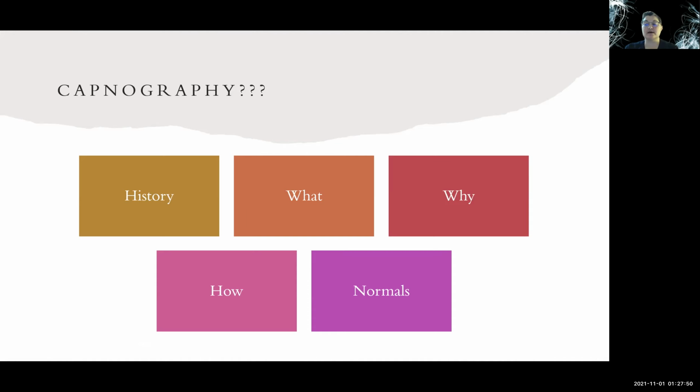That means any abrupt decrease in CO2, or end-tidal CO2, ETCO2, can be an early and very reliable indication of an impending cardiovascular collapse or even cardiac arrest. End-tidal CO2 can also be a very reliable resource to assess the effectiveness of CPCR.